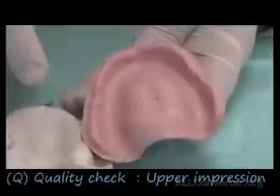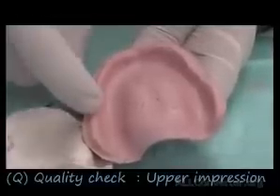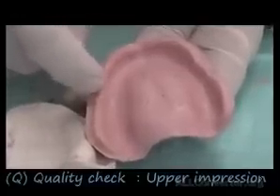We check that we have the anatomy clear, so I could see the buccal frenum notches here, left notches here. The labial frenum has left a notch here, the buccal frenum here. The surface has recorded the rugae area, the tuberosity areas, they are the same as in the patient's mouth. A very small bubble is acceptable. The hamular notches are well recorded and clear on the impression.